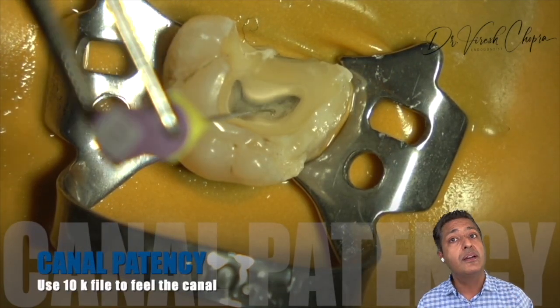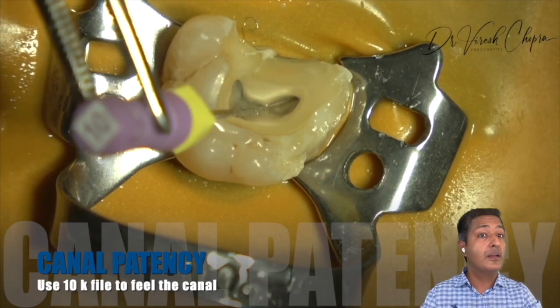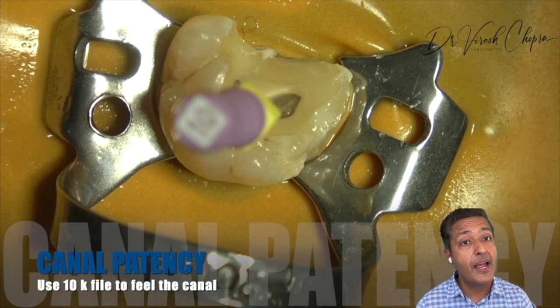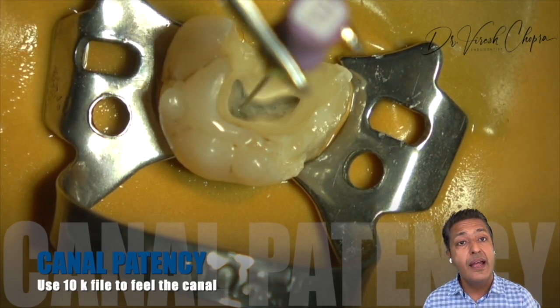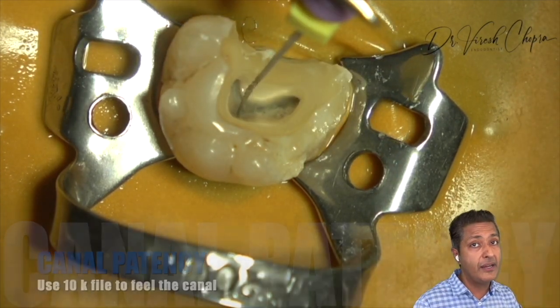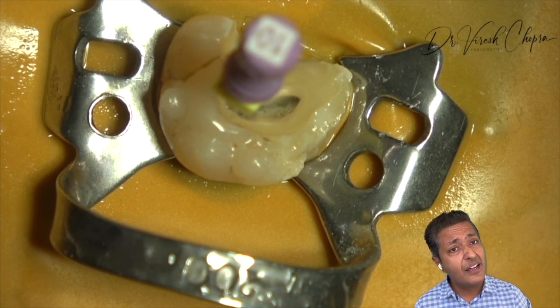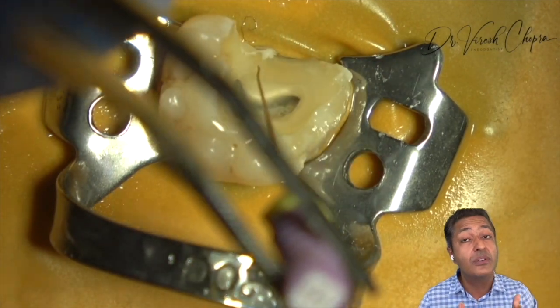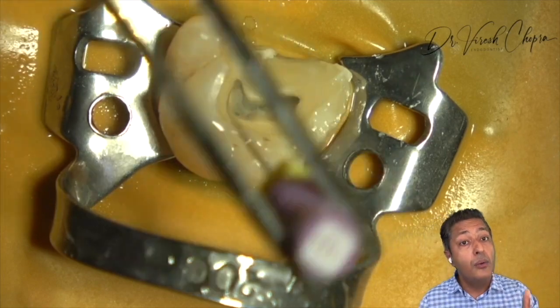Now whatever canals are present are in this particular area only. So we need to use our DG16 Explorer and find the orifices, soft spot, soft dentine, and then place an 8K file or a 10K file to check for the canal patency. Now basically canal patency is a step which tells the dentist how the canal feels like. This is your first introduction with the canal.